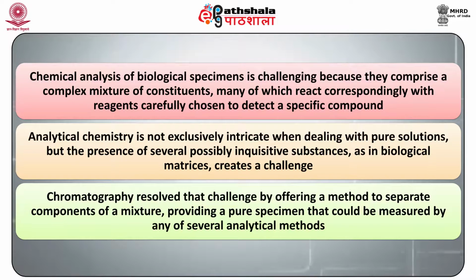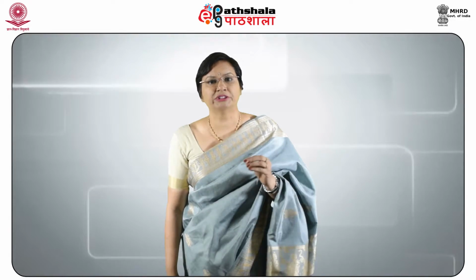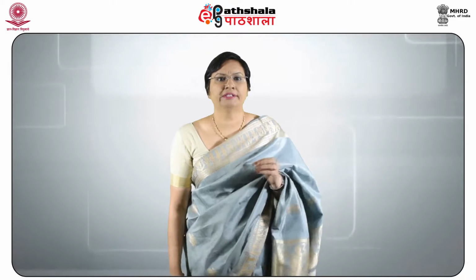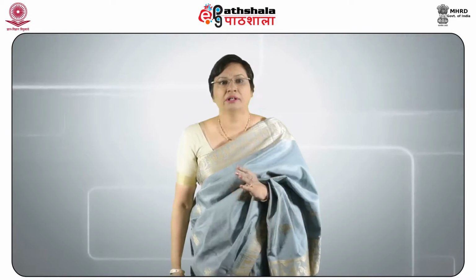Chromatography resolved that challenge by offering a method to separate the components of a mixture and thus providing a pure specimen that could be measured by any of the several analytical methods available. At the same time, as any technology adapts to the application for which it is appropriate, chromatography has developed to meet the exceptional requirements of biochemical examination.